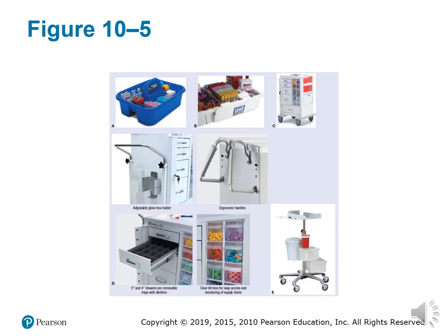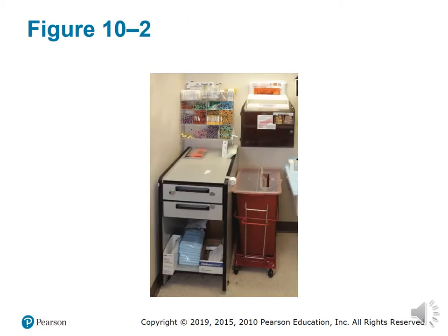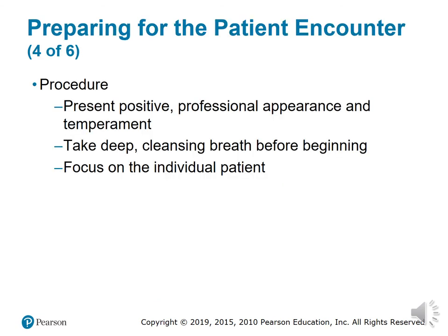Here you see phlebotomy supplies and commercially available carts or trays. Keep work area or counter space clean and free of debris. This is what a well-stocked phlebotomy workstation looks like. Procedure.